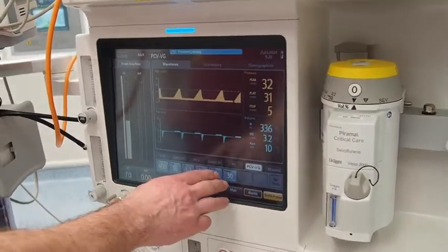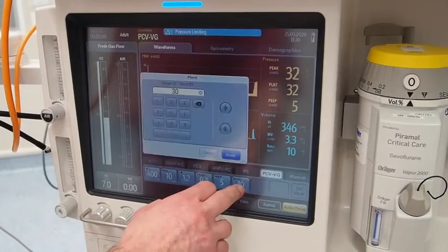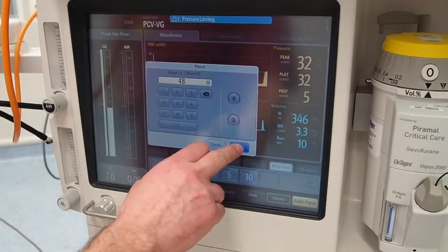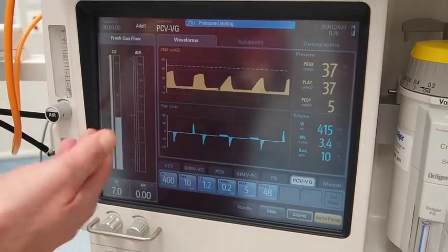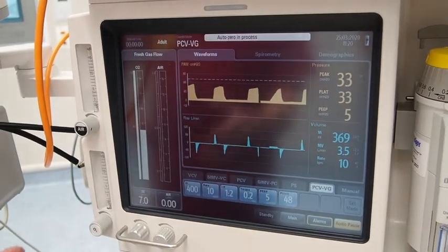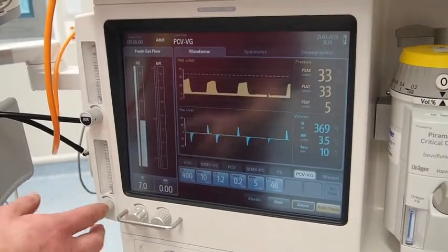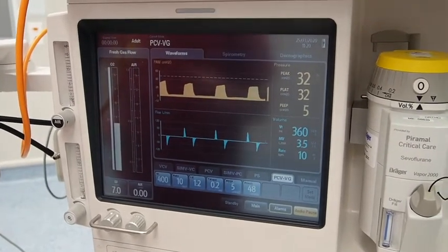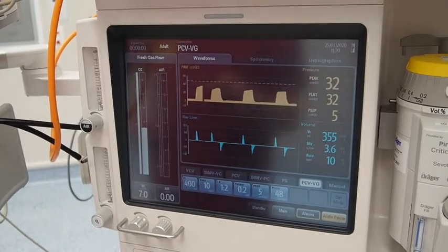You can adjust the PEEP, you can adjust your pressure limit. I'm going to turn this pressure limit up just because this bag is really stiff. And you get the same flow pictures that we get on an ITU ventilator, it's all very much the same. Now I've got 7 litres of oxygen dialed up here. You do not set the FiO2 on these machines the same way as you do on the ICU ventilators.